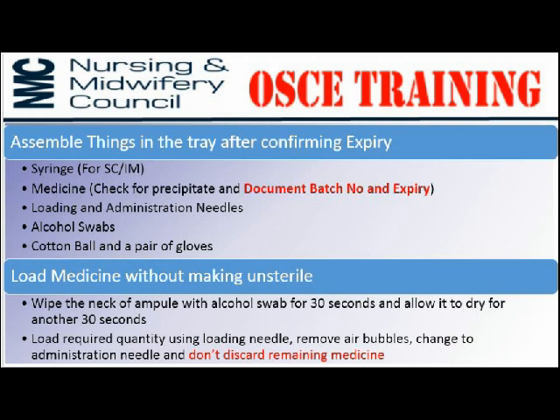For subcutaneous injection, you can use the alcohol swab to clean the neck of medicine, usually in an ampule. For IM injections, you can take 2 swabs, one to clean the medicine and one to clean the site. Then you also need to take a cotton ball to press the site after giving the injection. Make sure that you don't massage the site. Then you also need to take a pair of gloves for administering the injection.